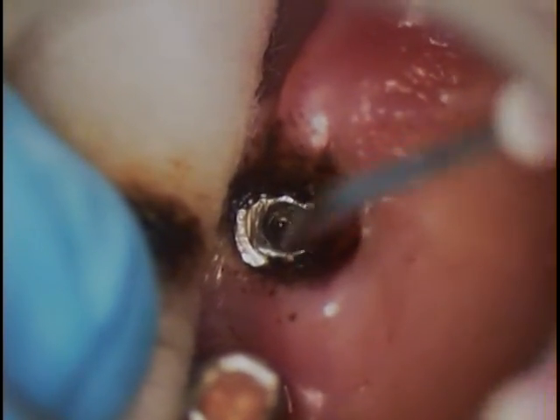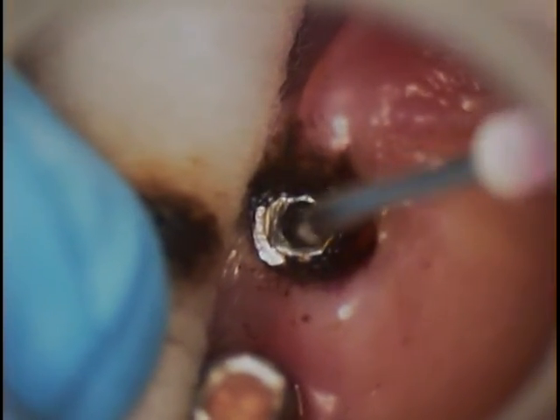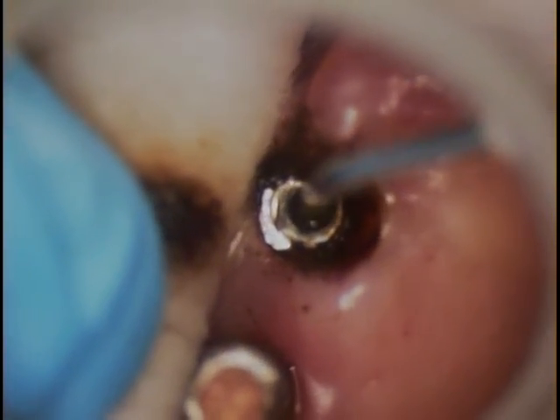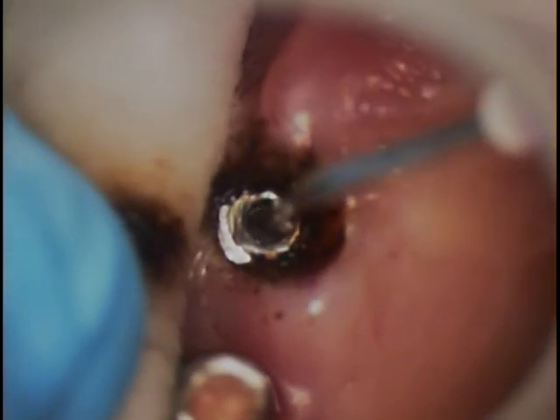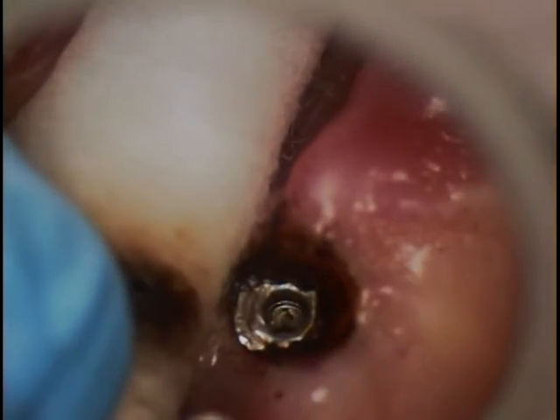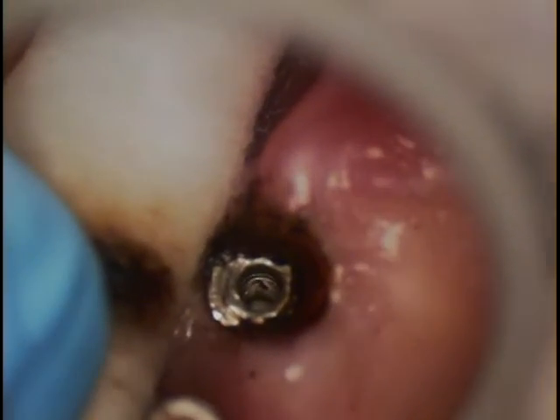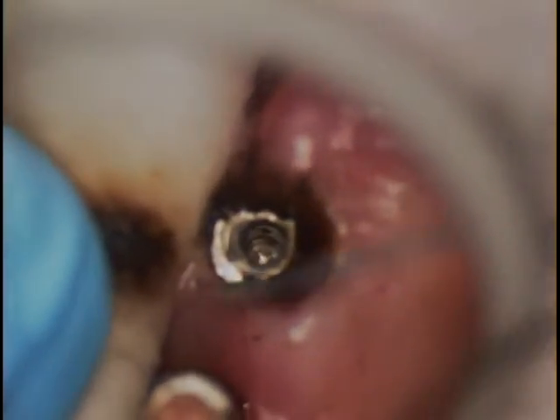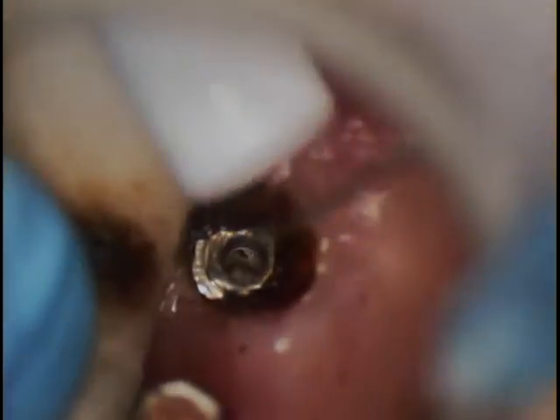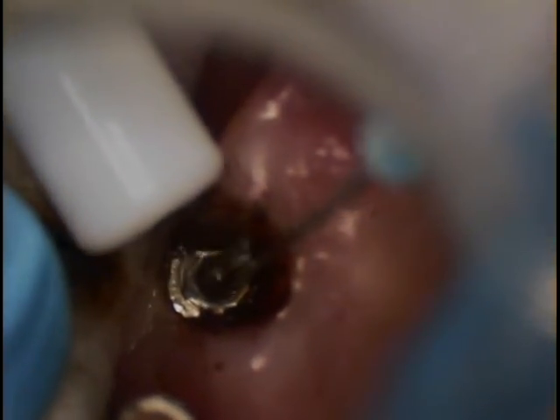Before we weren't able to identify threads at all. Now we're actually threading through, but there may be some issues further down that we can't see. I can see something down in there, so that might be tartar blocking it.